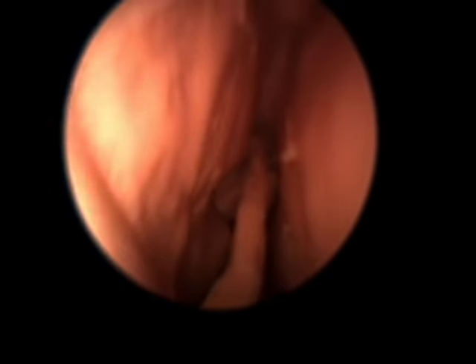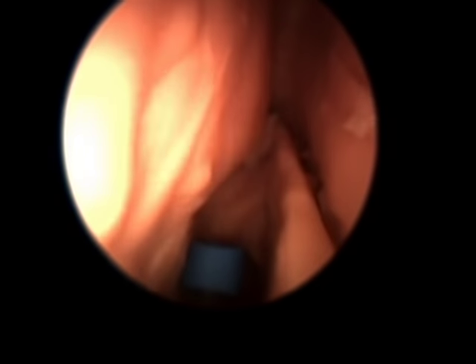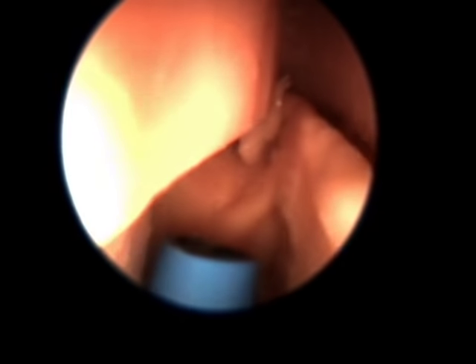Balloon Sinuplasty by Dr. Christopher Chang. Produced by Fauquier ENT Consultants of Warrenton, Virginia. Here we are inside the right nasal cavity about to perform a balloon sinuplasty of the right frontal sinus.